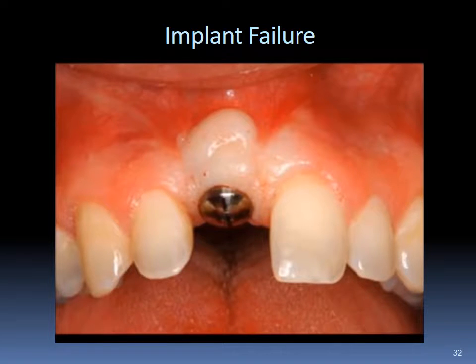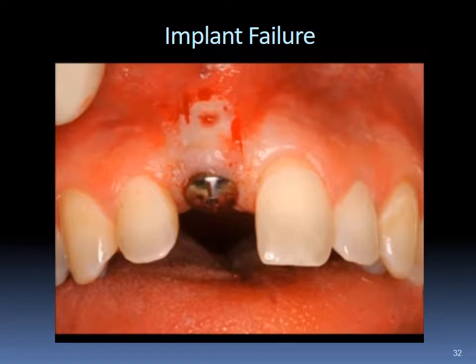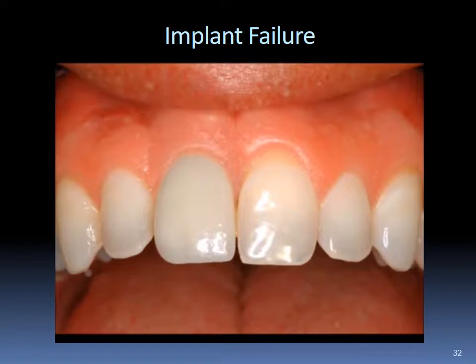diameter tissue healing cap. Before returning the patient to his general dentist, the facial tissue was skived, a plastic surgery procedure that created a more harmonious tissue blend. The general dentist performed bleaching on Robert's teeth and then placed a crown on the implant. It is evident that a very acceptable prosthetic result was achieved.